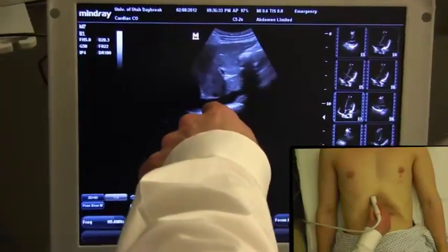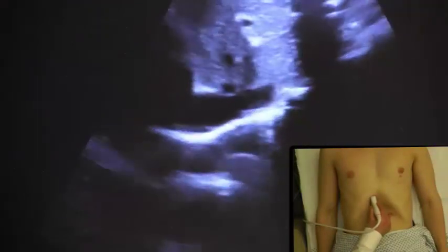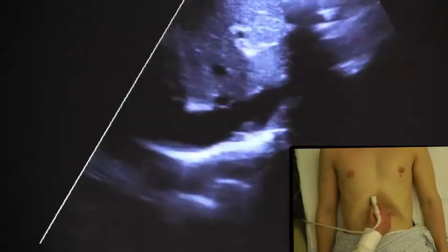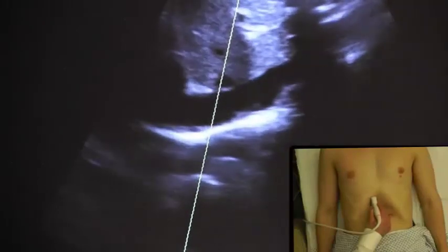Using the liver as the acoustic window, I'll scan through the right upper quadrant looking for the IVC and pointing up into the chest so that I can see the IVC dumping into the right atrium.